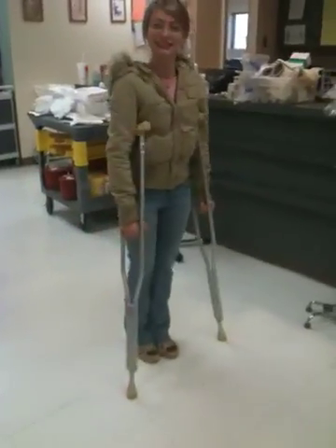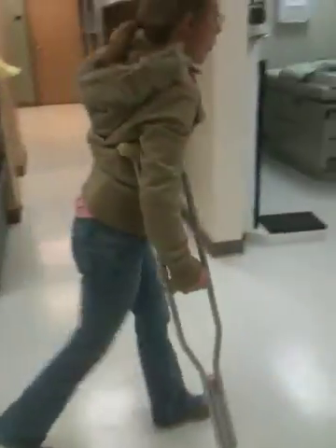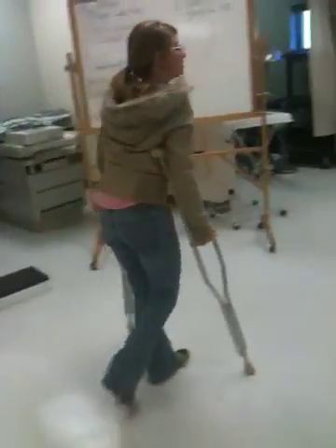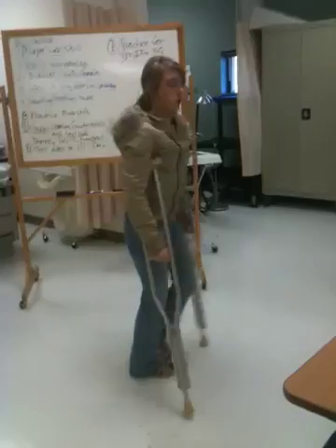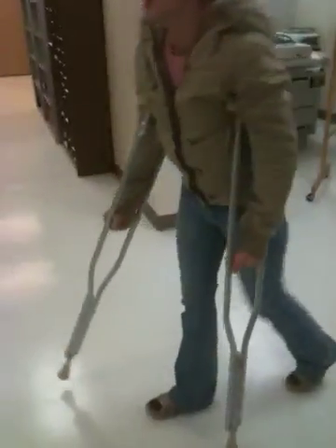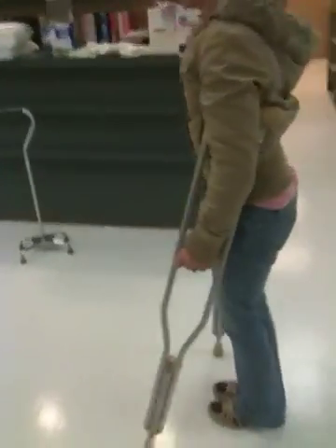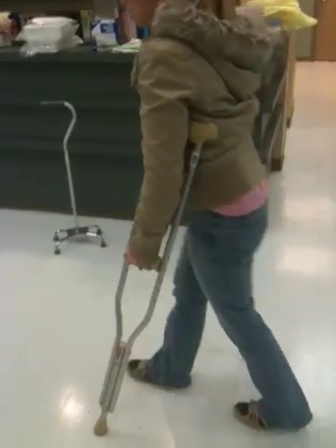Now do a two-point. Skiing. That's it. I'm not real sure what the injury purpose is. Okay, do a four-point. Four. I have to think about it. You're actually doing a two-point, because you're swinging your foot and your crutch at the same time.